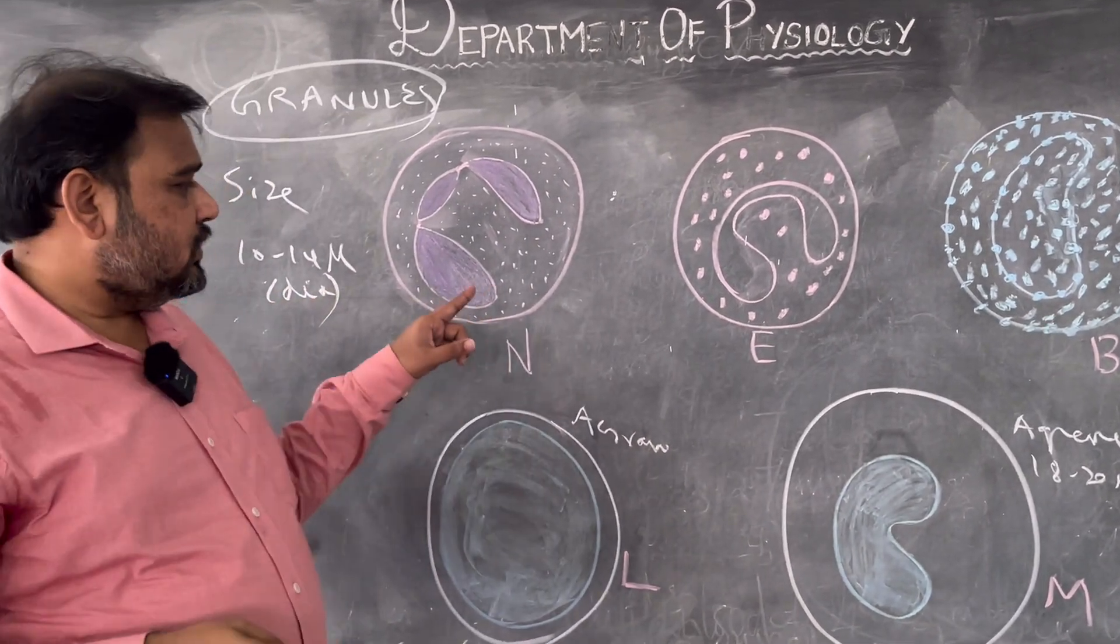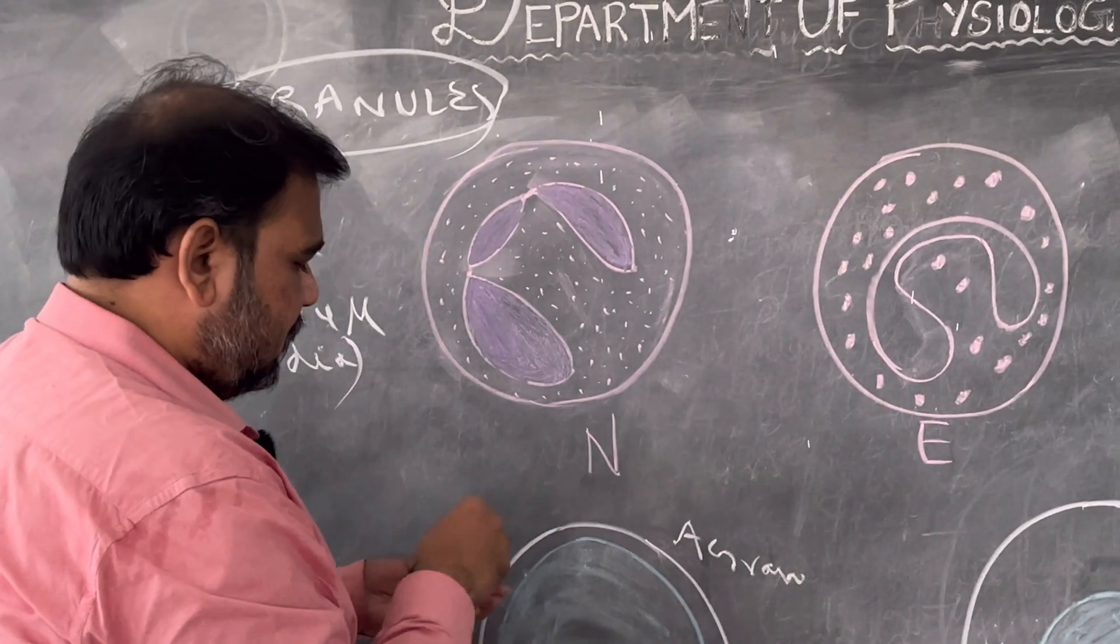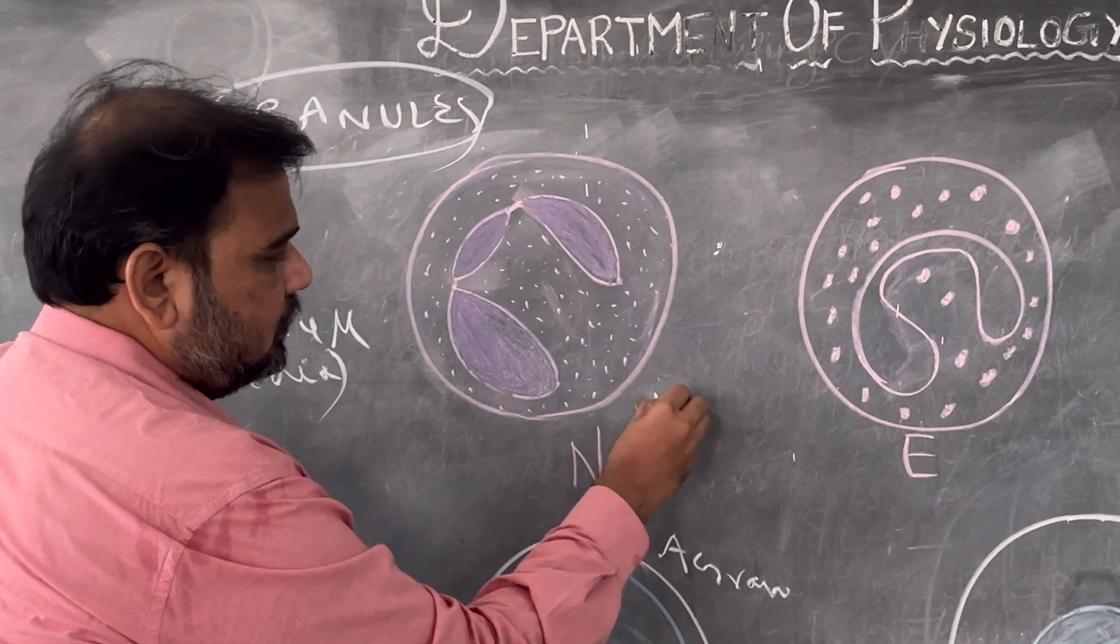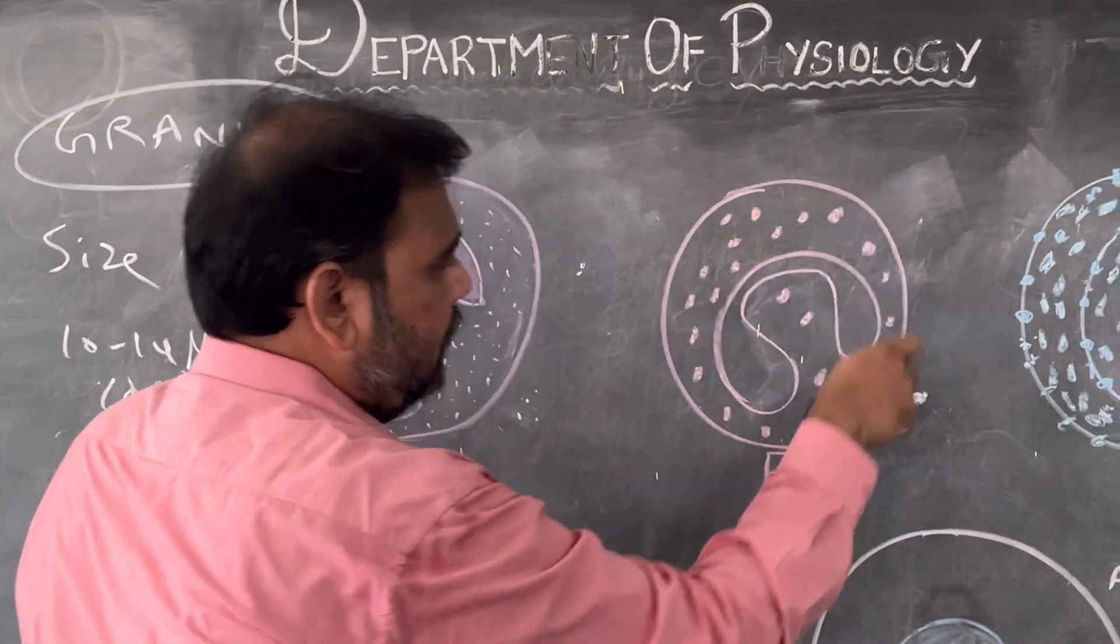Now coming into granulocyte, see here just concentrate. Here the granules are fine, for example it is like this. Fine, thin.